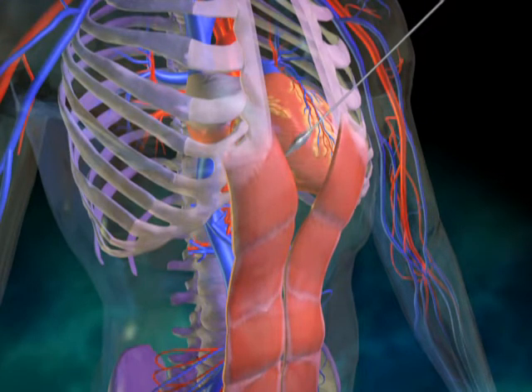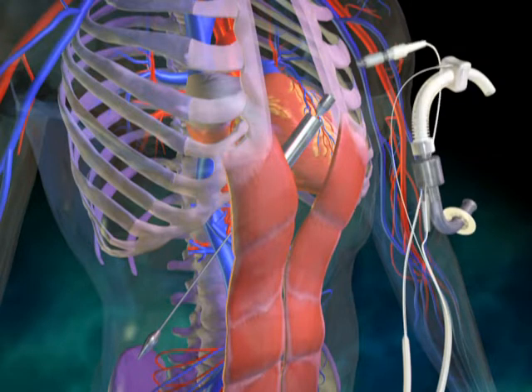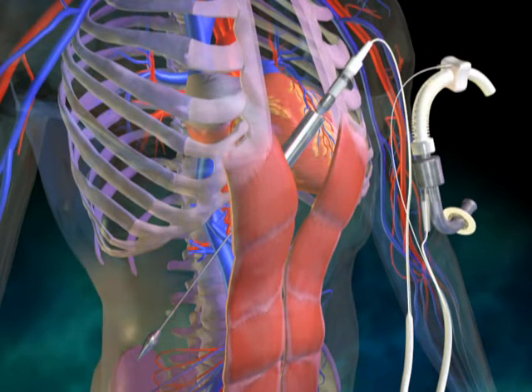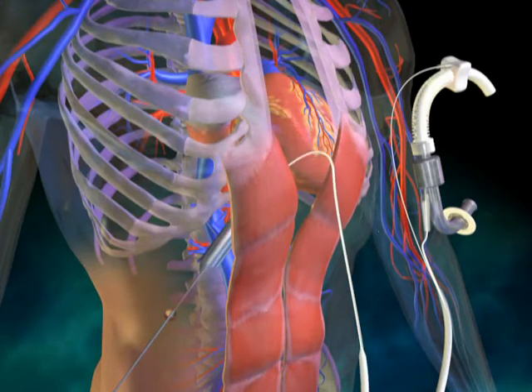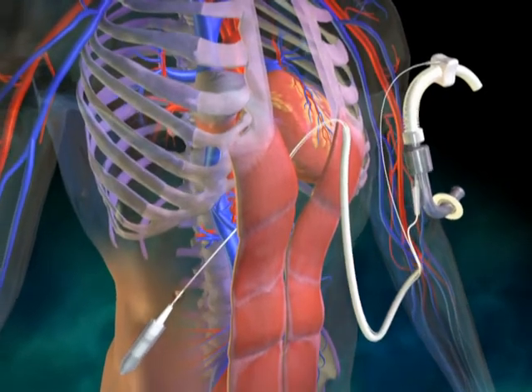Next, the controller driveline is tunneled in the abdominal wall across the midline, where it will exit through the skin at a convenient position just above the right iliac crest.